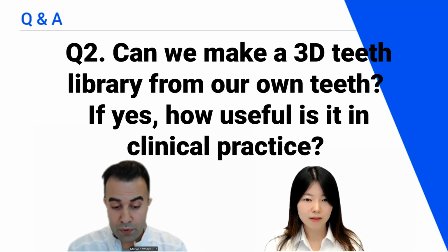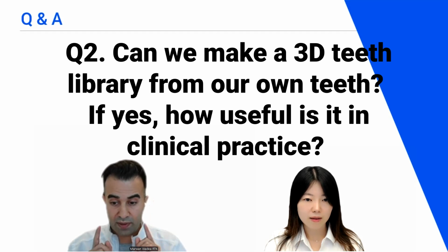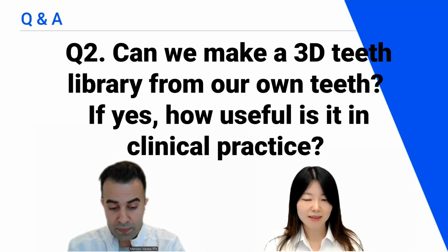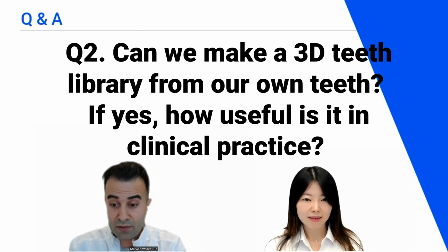The beauty, the power of digital dentistry is symmetry. We understand left and right. We want them to be symmetrical to a certain degree, especially the canines and the premolars, and the centrals have to be 100% symmetrical. In the past, we would recommend that a patient get two veneers, even numbers, because copying every single corner from one tooth to the other by hand is quite hard. However, with copy and mirror then paste, that makes it possible.